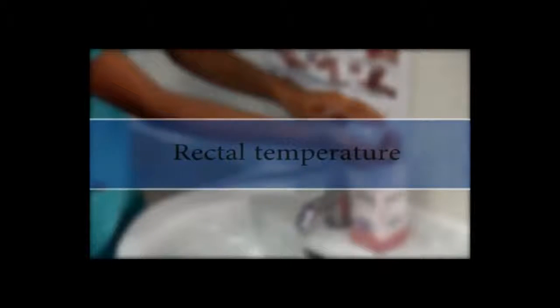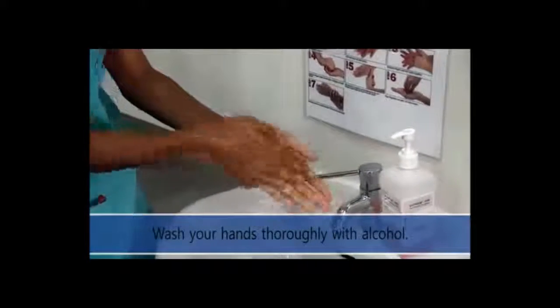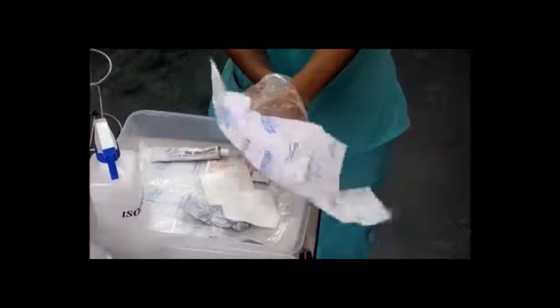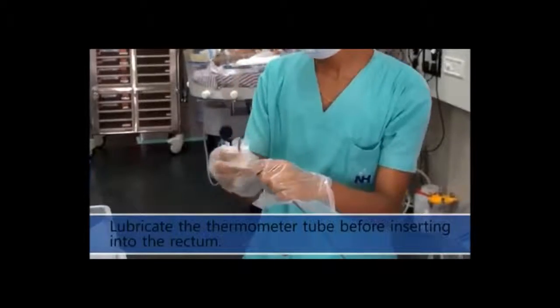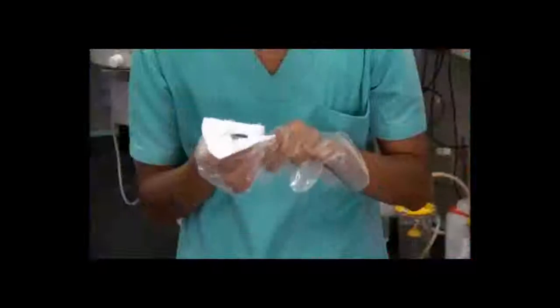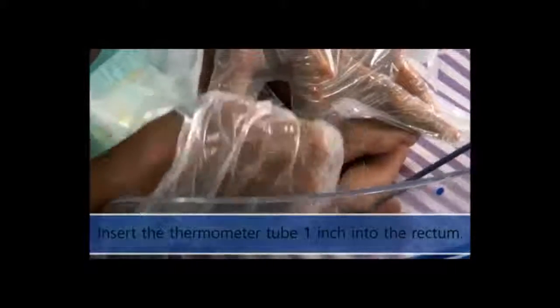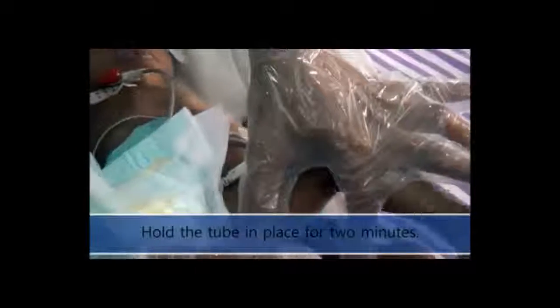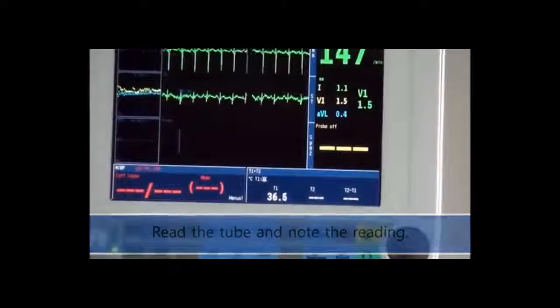Measuring rectal temperature. Wash your hands thoroughly with alcohol solution. Wear gloves. Lubricate the thermometer tube before inserting into the rectum. Insert the thermometer tube 1 inch into the rectum. Hold the tube in place for 2 minutes. Record the reading.